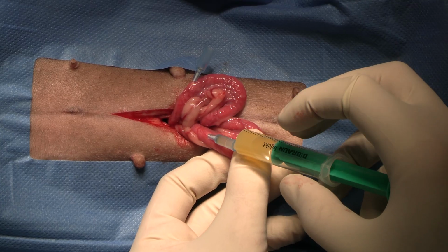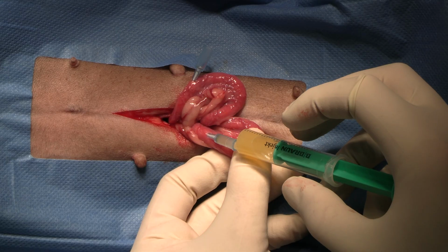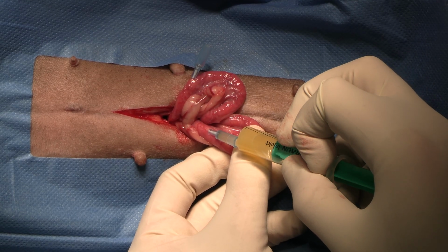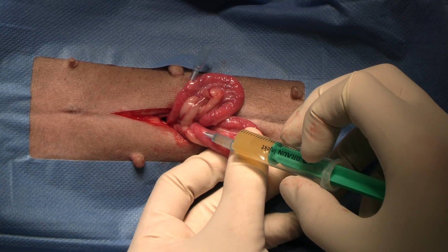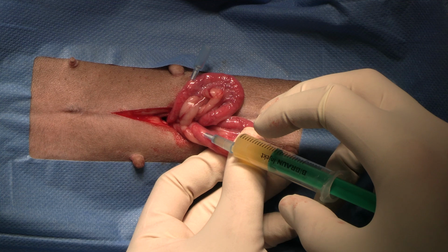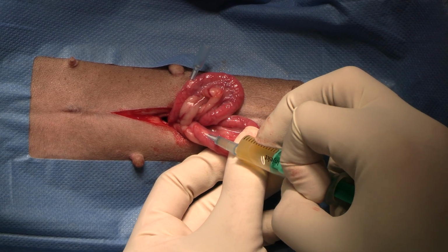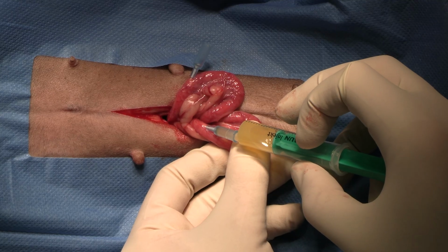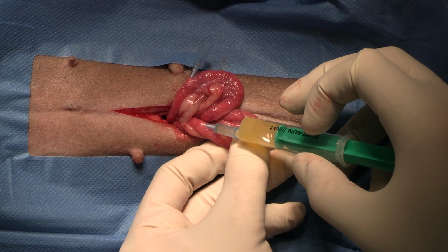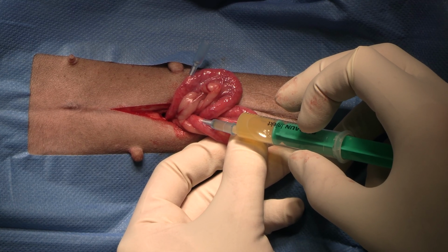Why do I pinch off? I just want the semen to go forward towards the ovaries before going back. We're injecting slowly. Why? Because we don't want to just squirt it all out, particularly if we're going to make a mistake and we don't want to squirt it outside the uterus. Doing everything slowly, just make sure that if something is incorrect, we can correct it. It's also to help make sure that the semen doesn't just shoot all the way out the back.